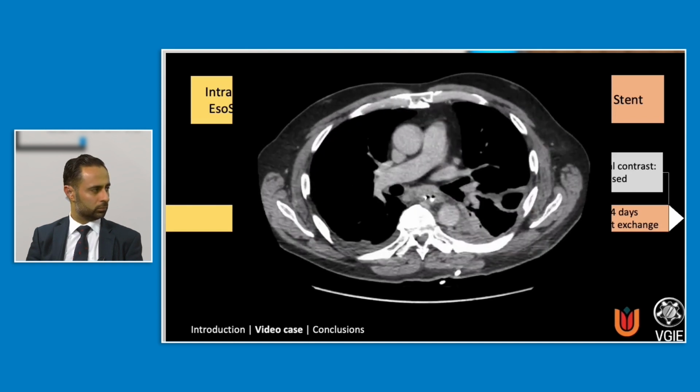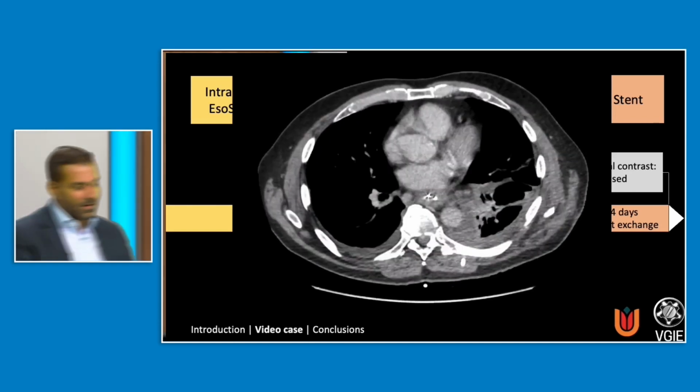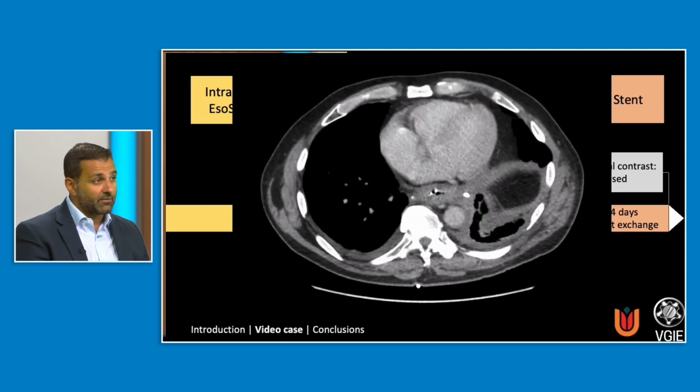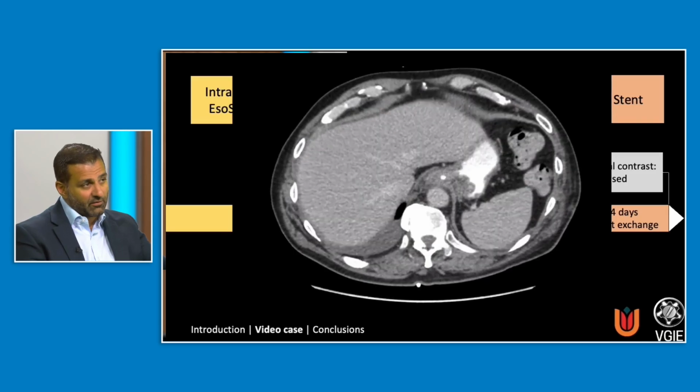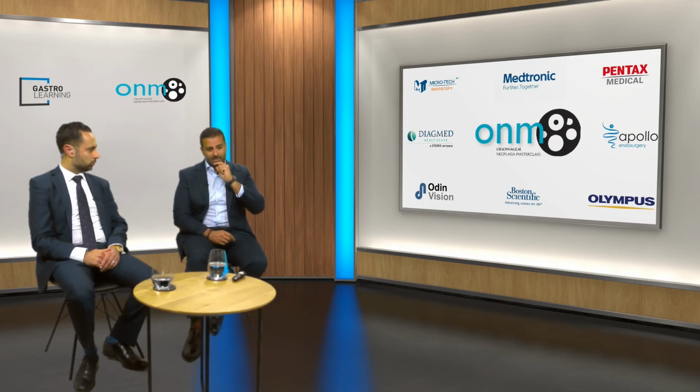We started using the sponge, and this is very work intensive. One is you need to change the sponge. I'll talk about the VAC stents in a second. It's every 3 to 5 days. And it's really important that they're on constant negative pressure. And by negative pressure, I mean between 100 to 120 millimeters of mercury negative pressure, and that needs to be on, it cannot drop. If you lose that even for a second, then you've lost the entire effect.